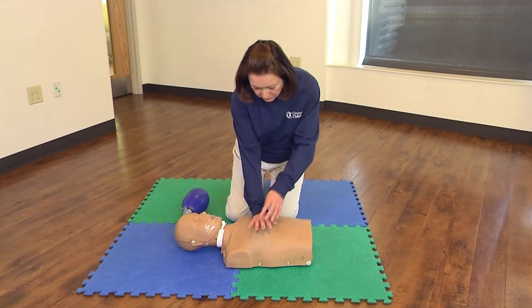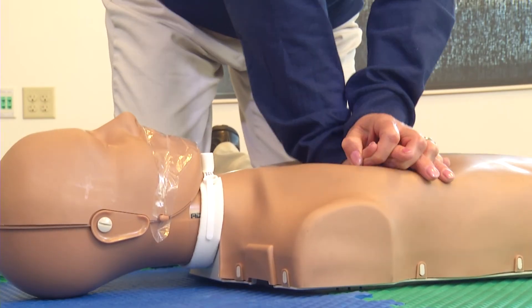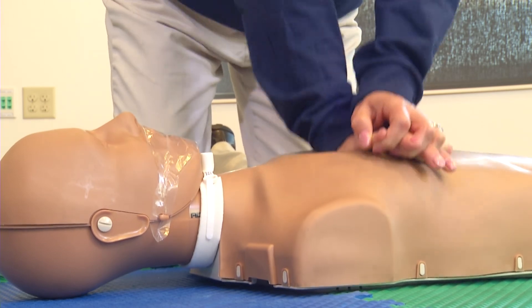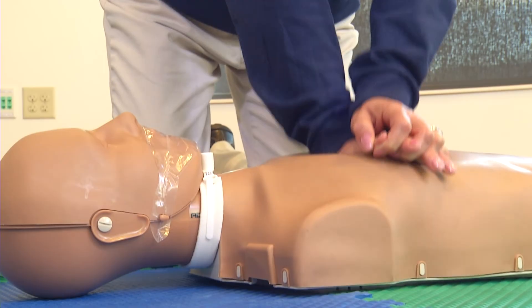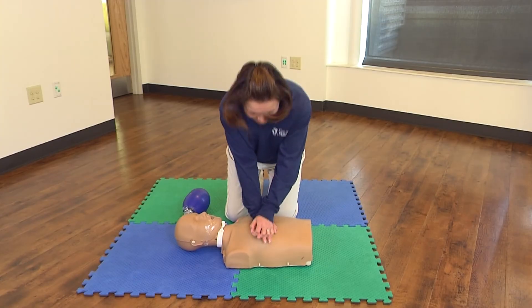Continue with 30 compressions and 2 breaths. 1, 2, 3, 4, 5, 6, 7, 8, 10, 11, 12, 13, 14, 15, 16, 17, 18, 19, 20, 21, 22, 23, 24, 25, 26, 27, 28, 29, 30.